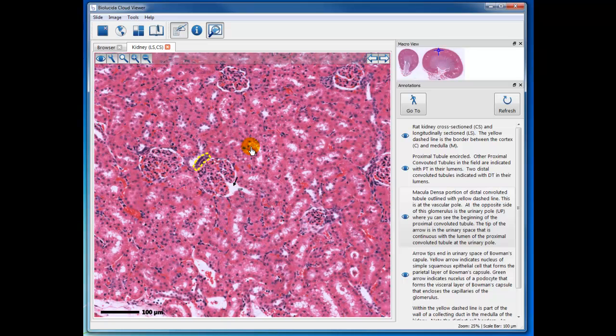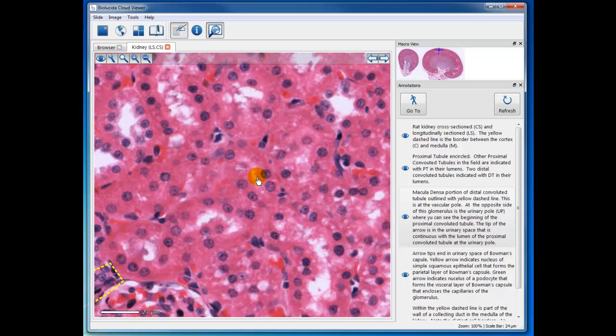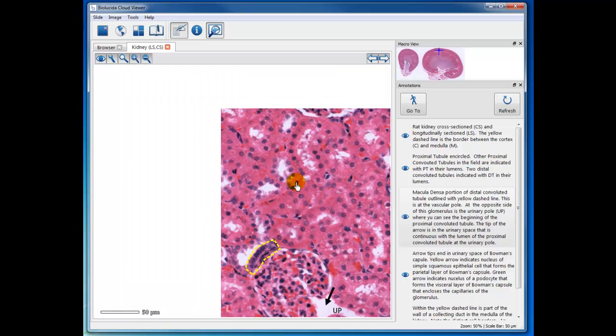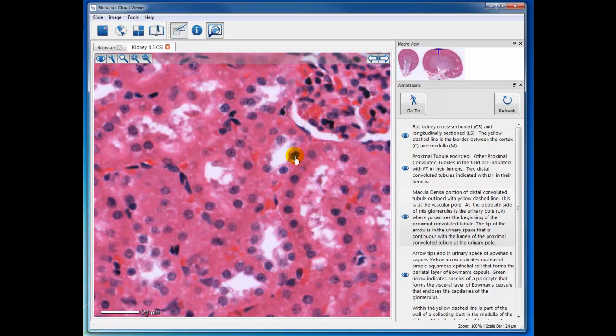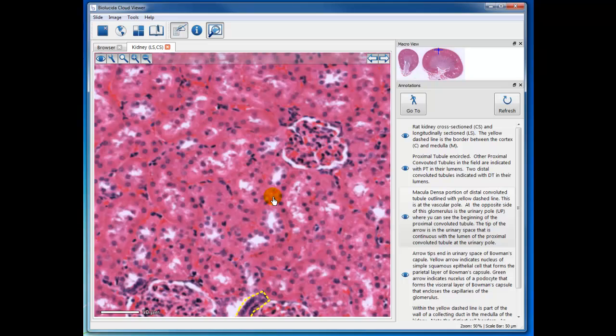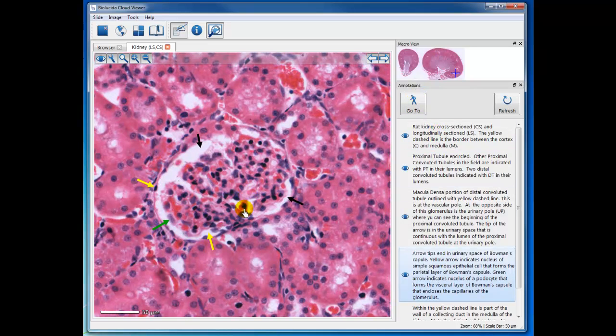And of course, the other challenge is to be able to know when you're looking at a distal tubule or a proximal tubule. In all the proximal tubules, the lumen looks pretty muddy because it's composed of a lot of long microvilli, whereas the distal tubule is very clean. This is a distal tubule here, and here the nuclei are usually a little closer together. So you'll need to look around. I'll try a couple more annotations.